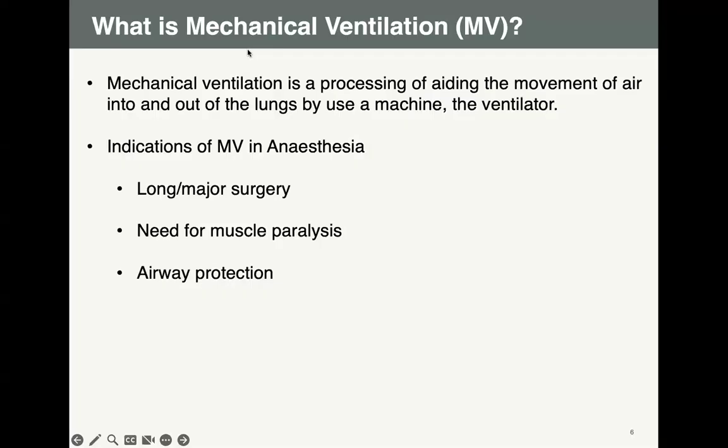So we have a good number of indications for mechanical ventilation in anesthesia. I believe we all do surgery, let it be in neonates, small pediatric, adults or elderly, and we go through long procedures whereby we are in need of mechanical ventilation. So for a long surgery or major surgery that needs good relaxation of the patient, mechanical ventilation is indicated. When you need to protect your airway, mechanical ventilation is indicated.